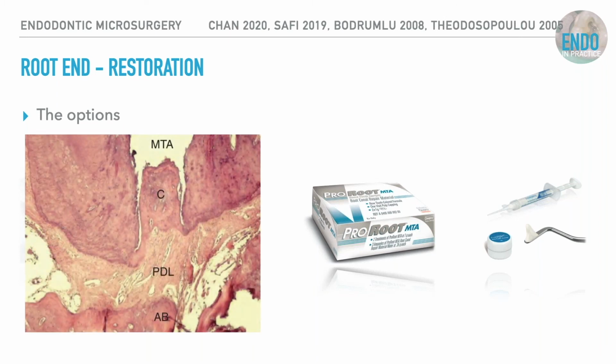Yes, there is, and it also takes into consideration that this surgery is a mosaic of different elements. Just because you stick in MTA into a surgery that you haven't planned correctly and you haven't executed the rest of the procedure well, the MTA is not going to save you. Likewise, if you've done the surgery really well but stick in IRM or something like that, that again isn't going to save you. This is a mosaic of small pieces, marginal gain stuff, if you like sports science, to achieve the optimal outcome.